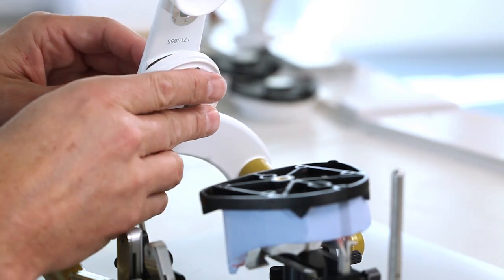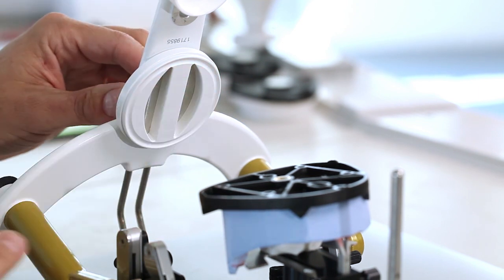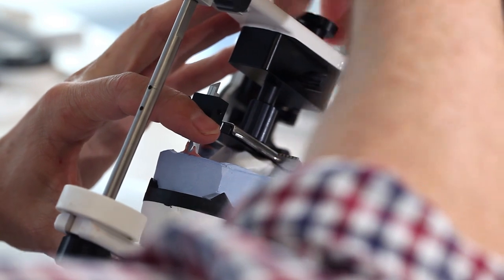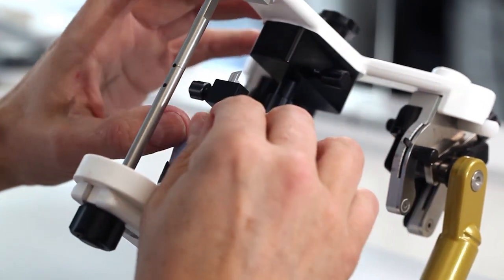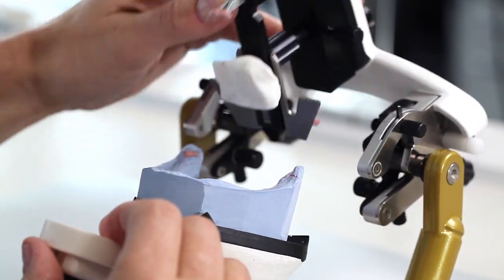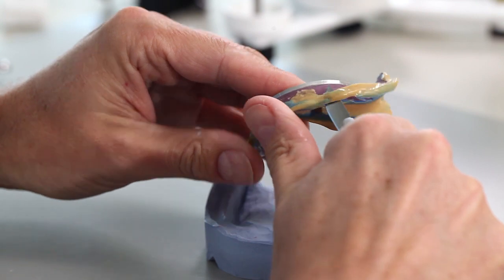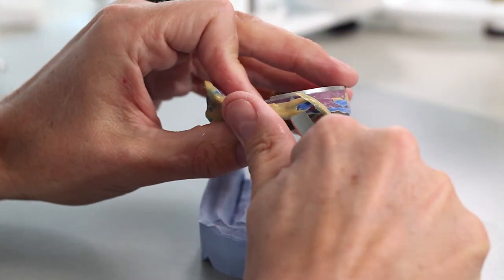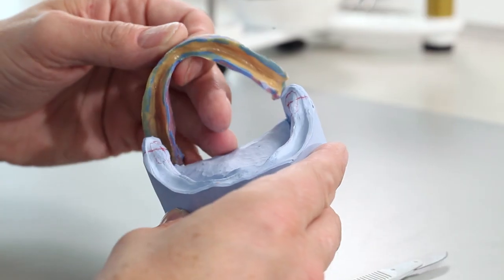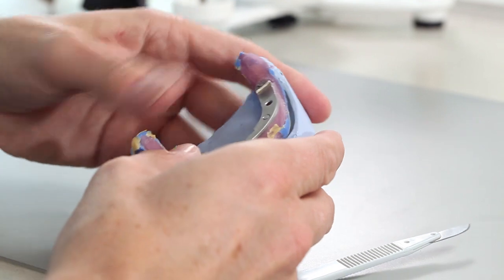Mount the base plate in the articulator and secure the mandibular model using dental plaster. Wait until the plaster has set. Then, cautiously remove the horizontal guide and clean the mandibular model. Cut back the functional impression of the lower jaw on the vestibular side. Check whether it closely fits the model.